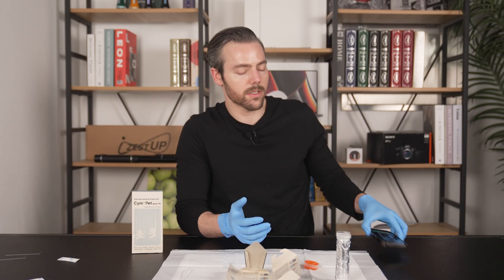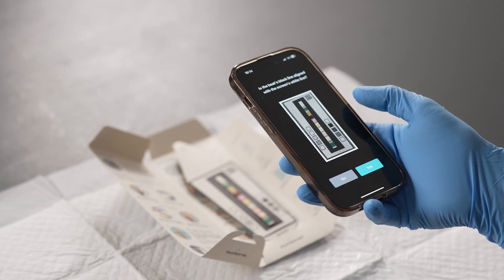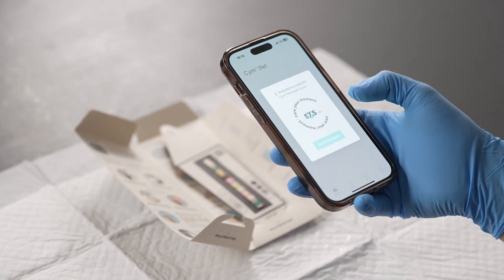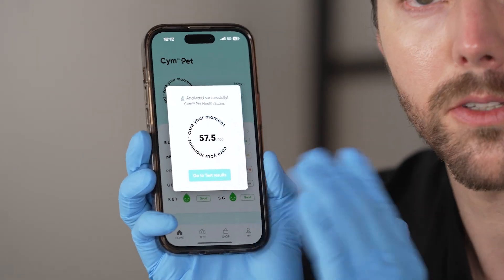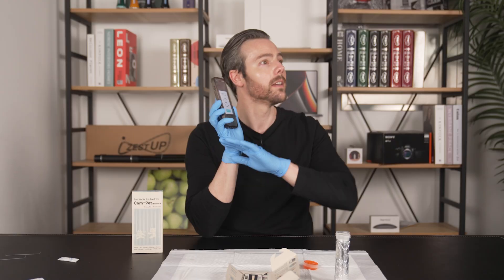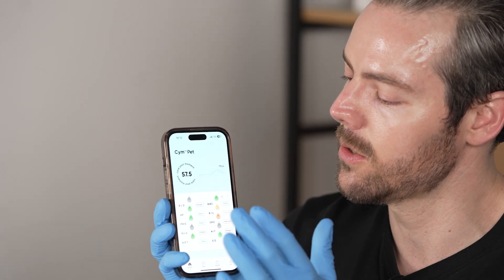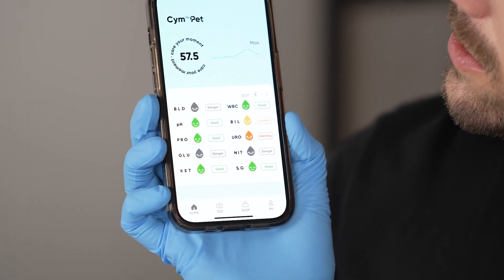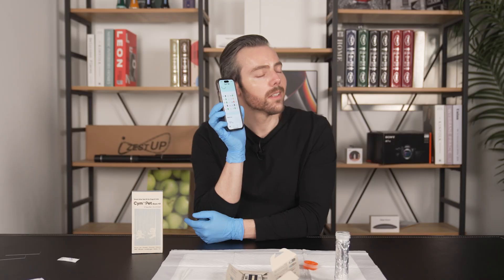Now it's been 60 seconds. Got the results — we're going to take a picture. 57.5. So the last one was 97.5, this one is 57.5. Exactly what we wanted to see — this one's messed up, this animal is in trouble. The other animal: perfect. This one, not looking so hot. Let's go to the results and see where they're struggling. You can see all these different metrics and it gives you a great readout.